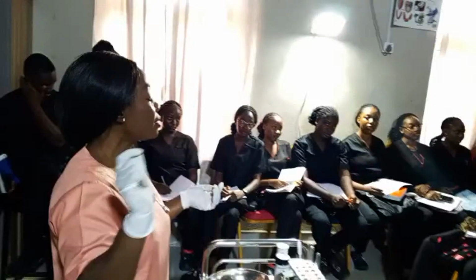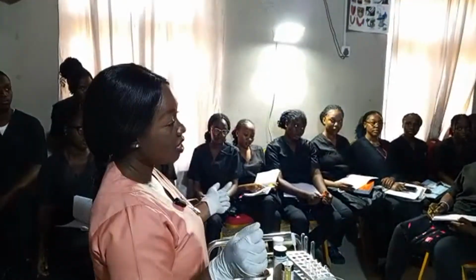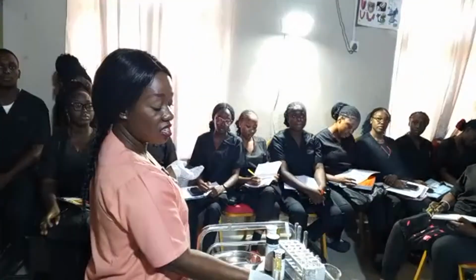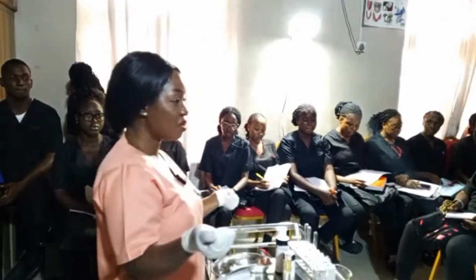Raise your hand. The graduating... All right, we place it on a flat surface and make sure that the urine is in a clear container that you can see, right? So what's the next thing? Physical examination.